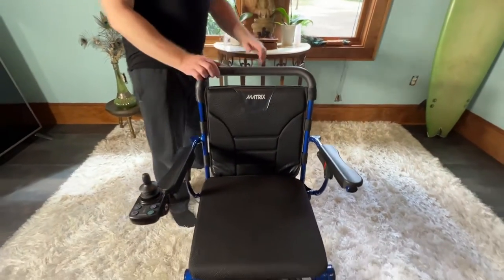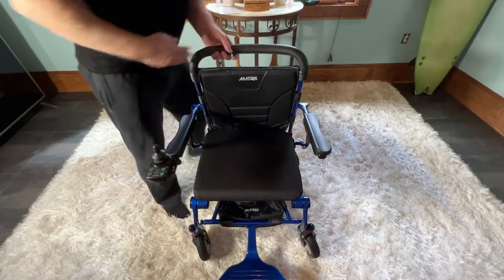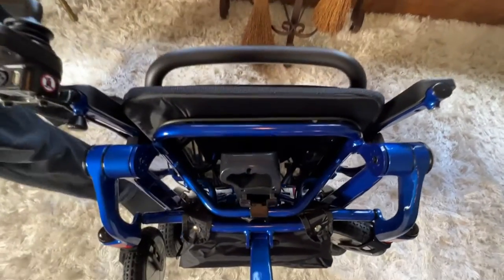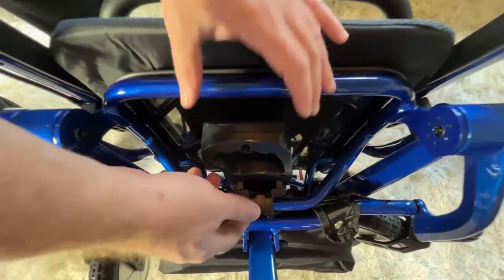The first step — and we've made a video about this, so I'm just going to go ahead and do it. We're going to fold the chair up and let's take a look at the top of the battery here. I'm leaving the footrest down. It is conveniently located — I don't have to bend down or be on my hands and knees behind the chair.